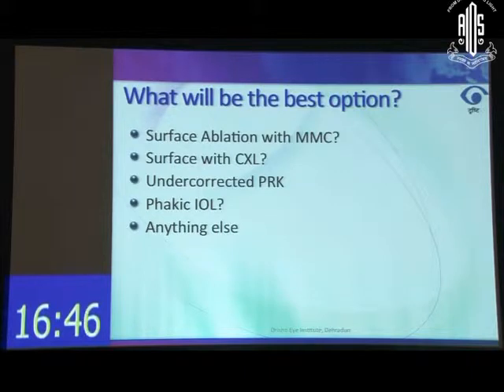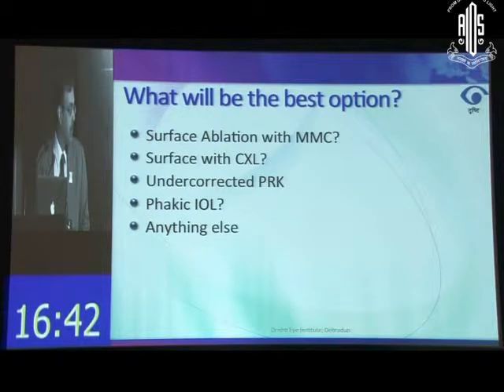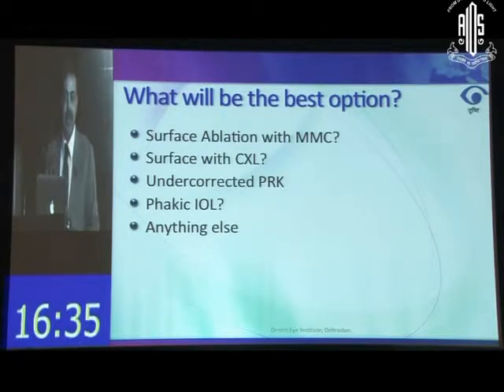Kumar, would you do something different? Your ACD from the endothelium was 3.29? 3.2, yes. There is no option except a toric ICL. Right. Even I would probably do an ICL for this patient, especially with that astigmatism and a large enough correction.